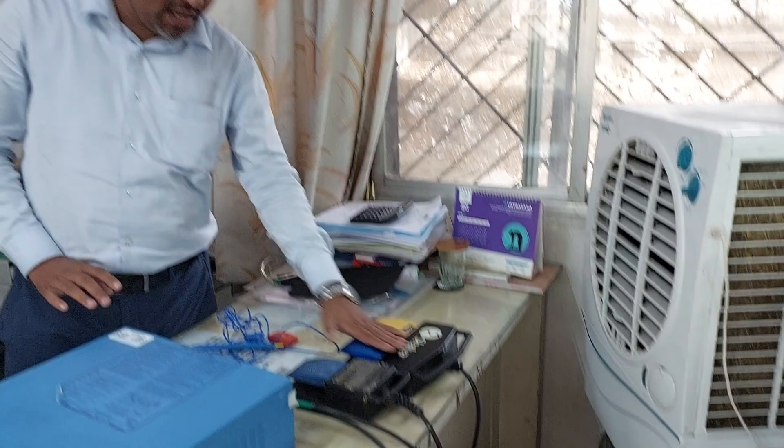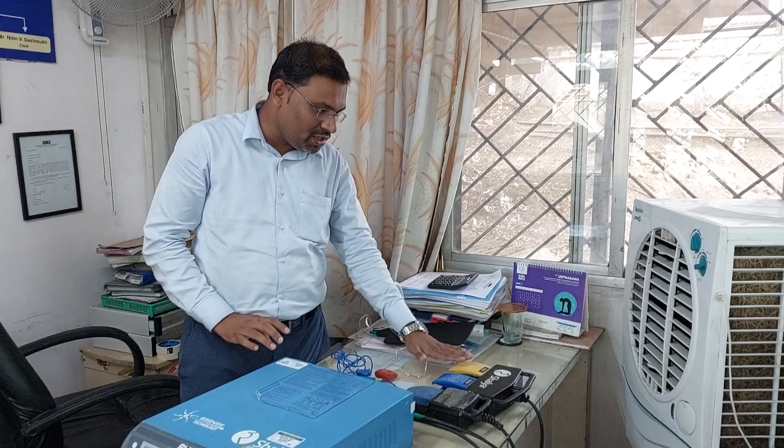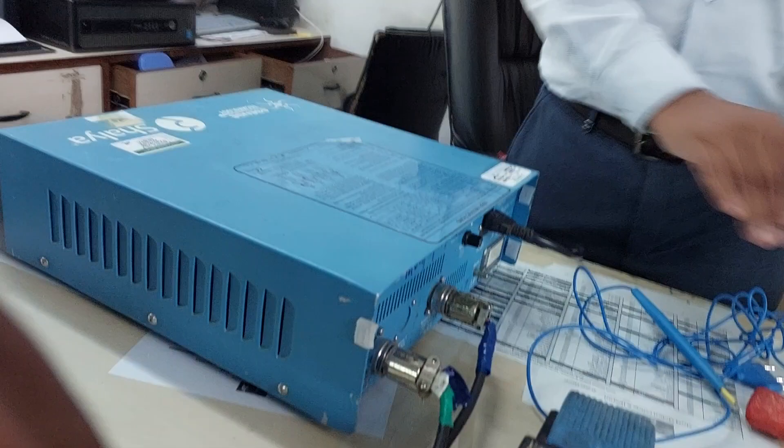With the machine they have also provided a foot switch. They use an identical color coding: blue is for coagulation and yellow is for cutting. At the back side the names are mentioned. At the bipolar socket you connect the bipolar, and at the monopolar socket you connect the monopolar.